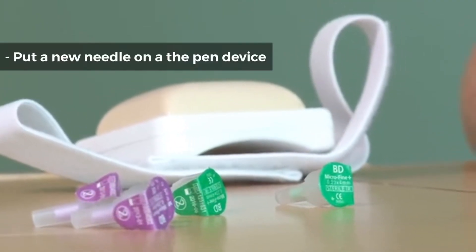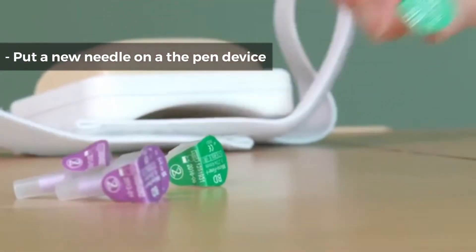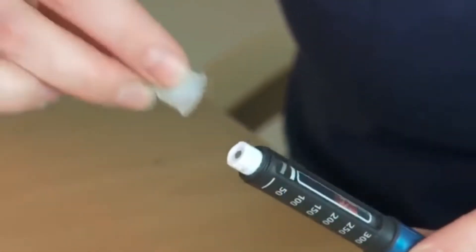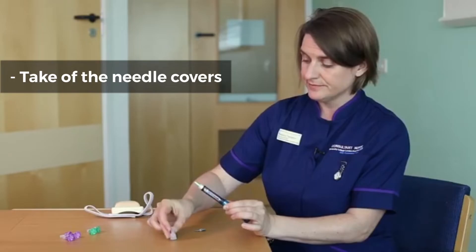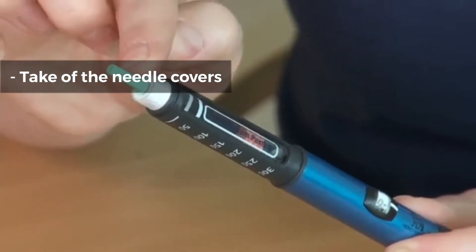Now you've washed your hands, you're going to put a new needle on the pen device. This needle, you peel off the end, take off the clear plastic lid, and then, being careful, take off the needle cover.